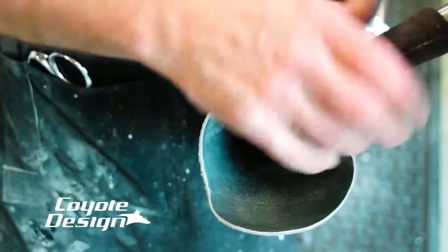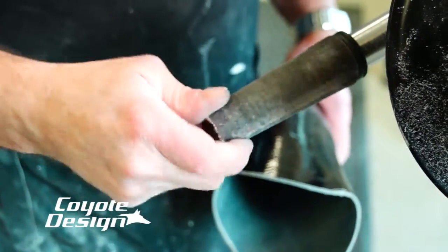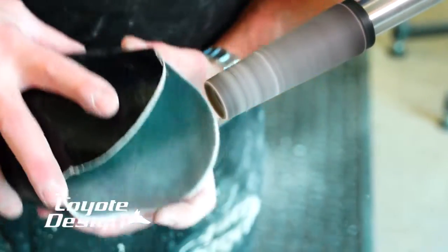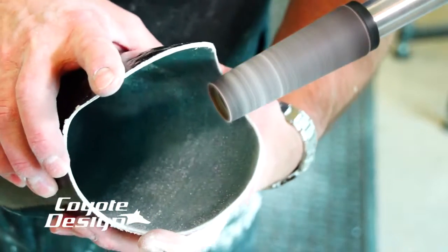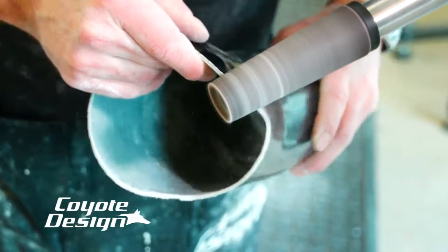After using the rough cone, I go ahead and use a finer cone, just going with the direction of the cone and hitting my edges. After I go rough, I go down to a finer cone, run my outside edge and inside edge, and then get ready to polish it.